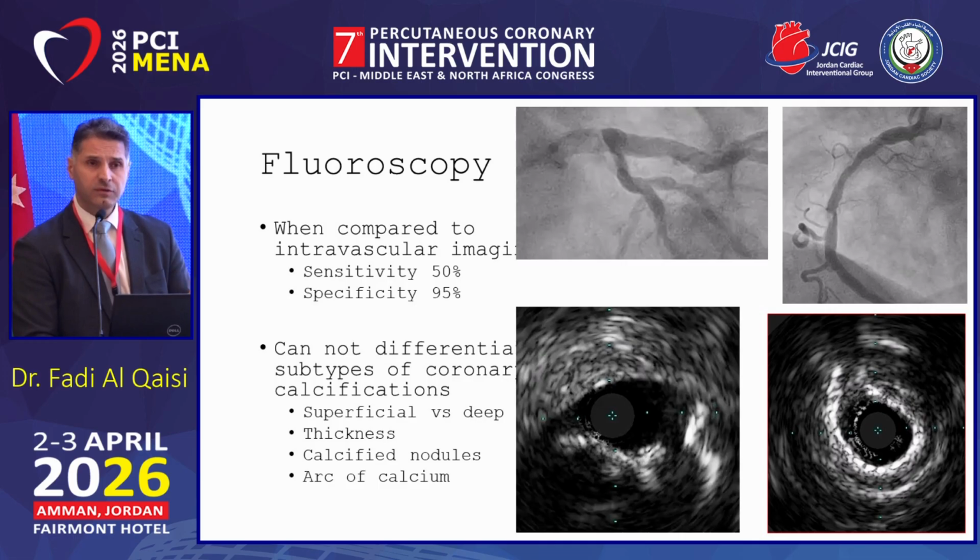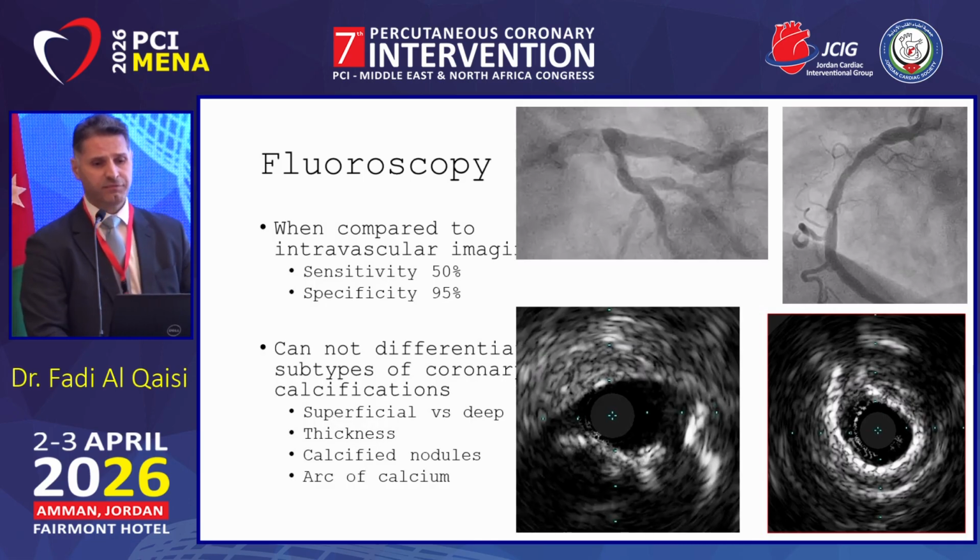These are two of my actual patients. The first one is the left main. Looking at the fluoroscopy and comparing the colors of the left main with the native LAD and the left circumflex, I thought this is a heavily calcified left main. This is going to be a nightmare. I need to have a Rota. Then I did the IVUS, and I saw the calcium was only on one side and not circumferential, and I did this case without any plaque modification.